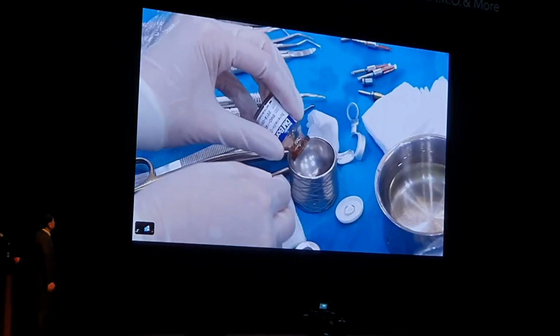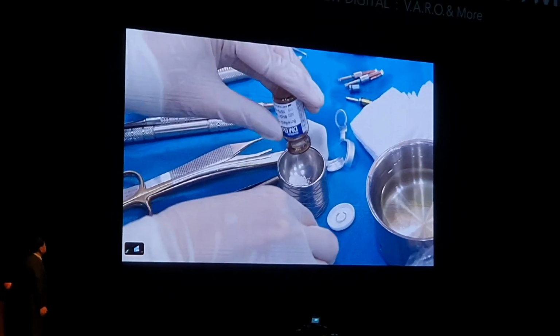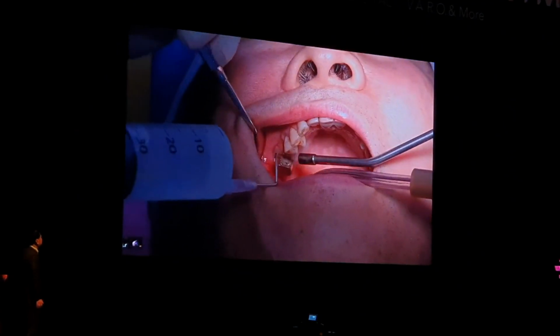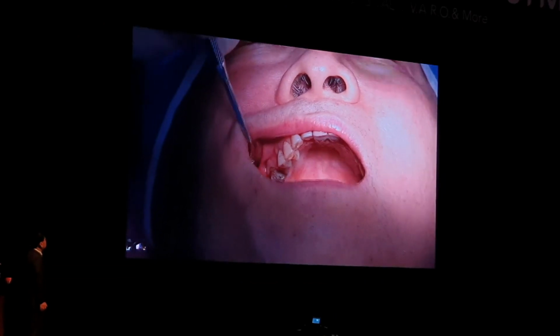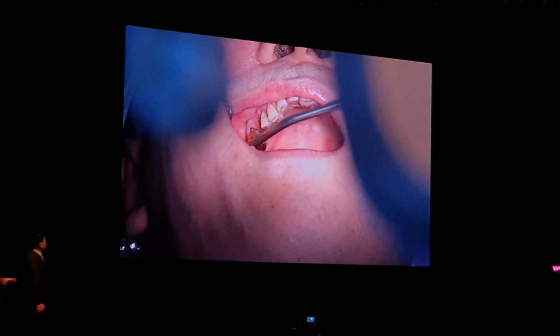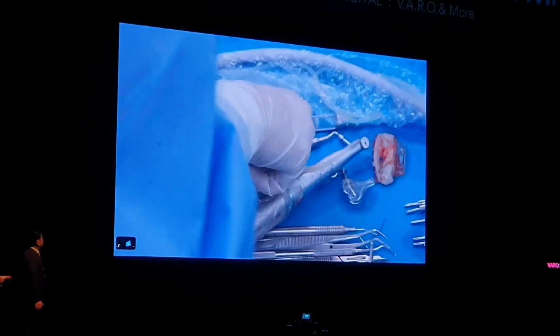Open your mouth. Open your mouth. Are you okay? Do you feel anything coming into your nose? So please prepare the DM bone, please. We will do the bone graft now. Connect the stopper, please.